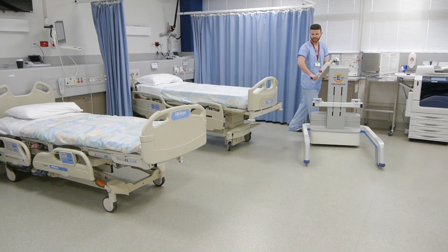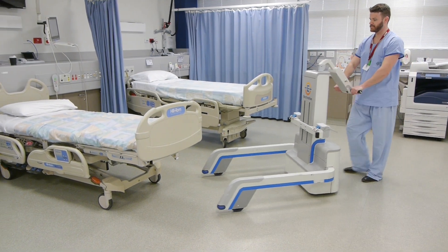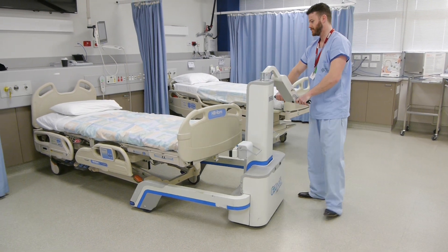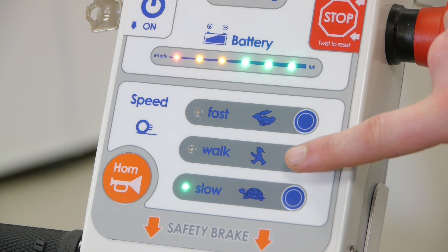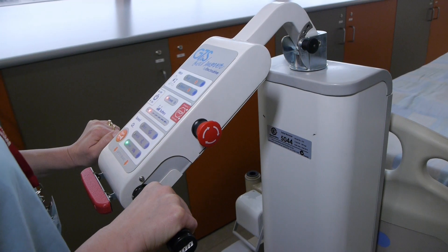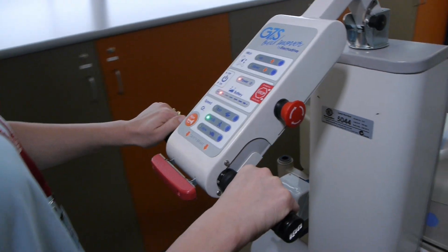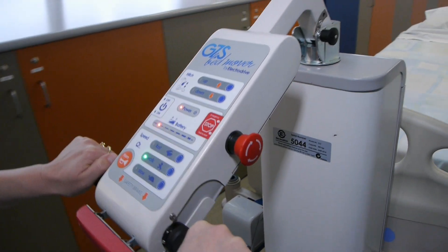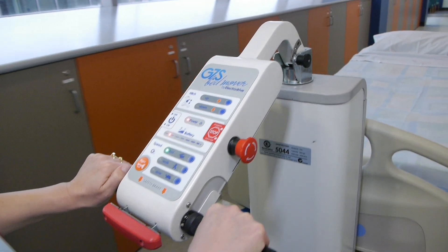Once you have the hang of moving forwards, backwards and stopping, you may want to use the speed selector to choose one of three speeds. The best way is just to begin with slow and, once you're comfortable, move on to the next speed. You can also control your speed using the throttle, where the more you turn it, the faster it goes.